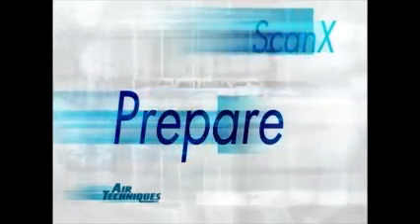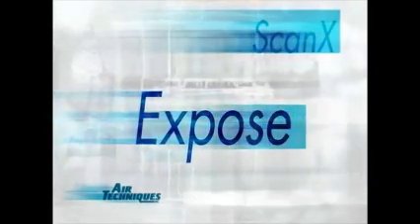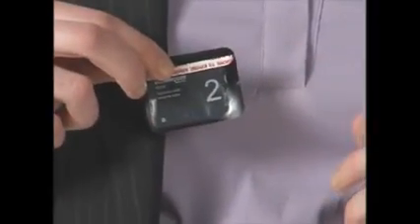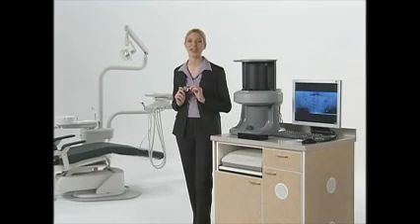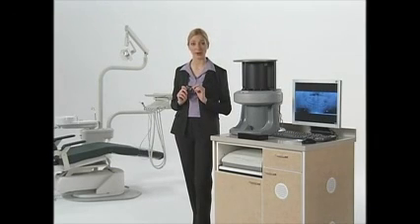This is a barrier envelope. Each envelope has a transparent side and an opaque side, and there's a little peel-off adhesive strip right here at the top. The next step is to prepare your plates for use. It's important to work with recently erased plates, and ScanX with inline erase makes this process easier than ever. Each plate is automatically erased after it is read.